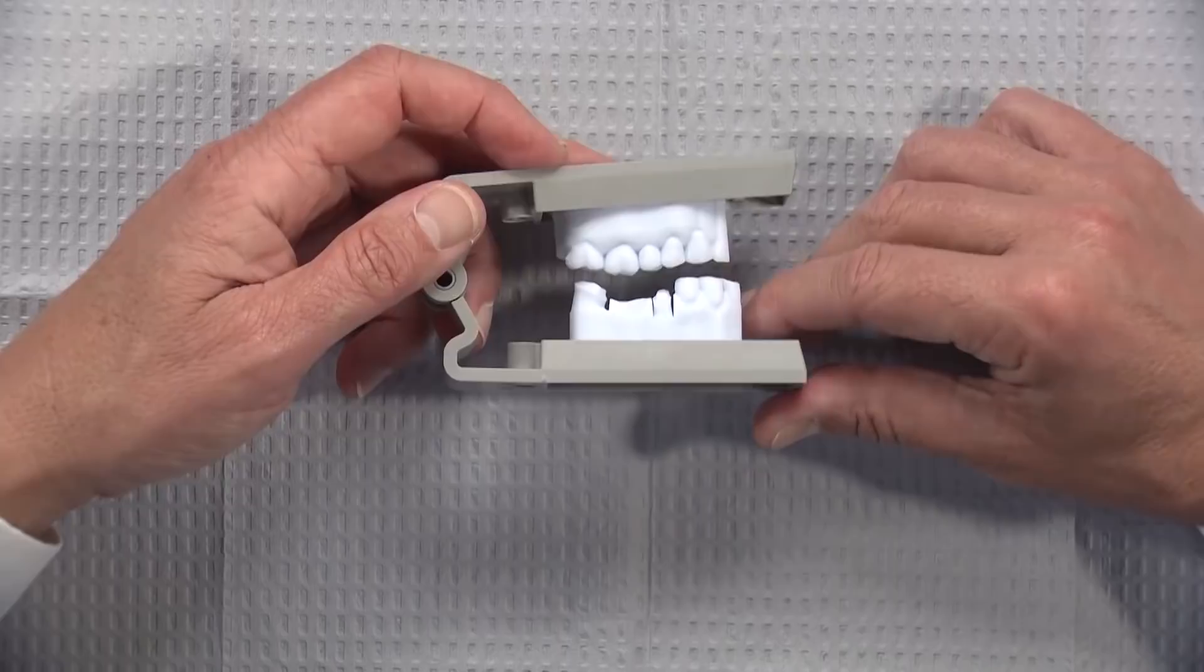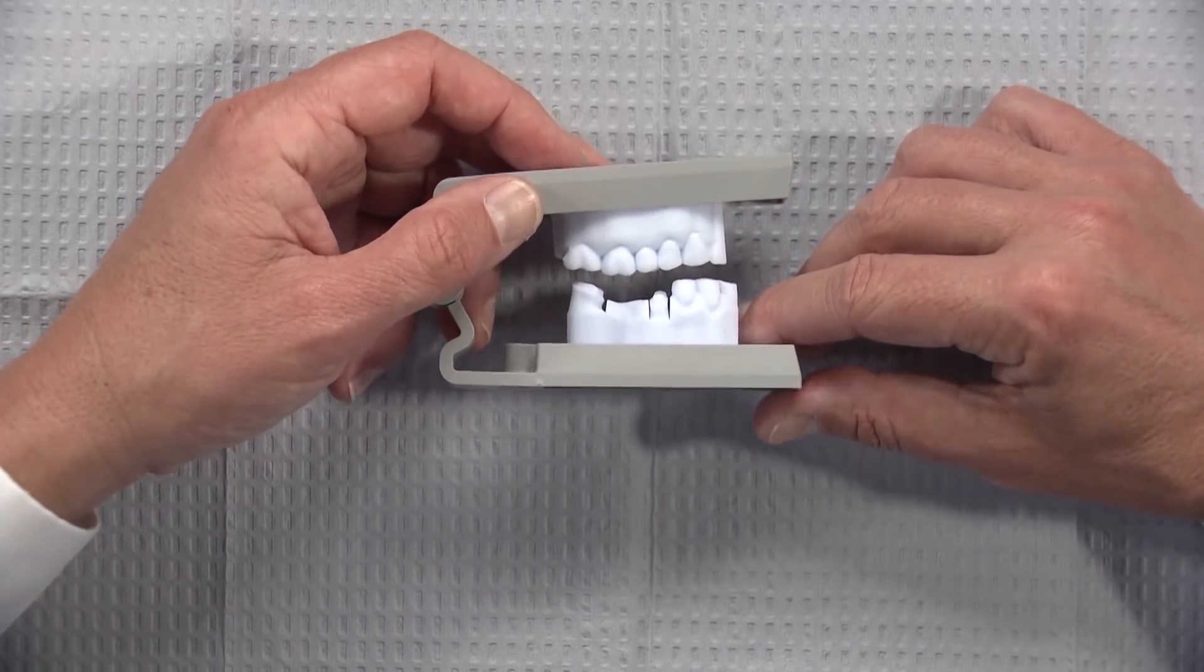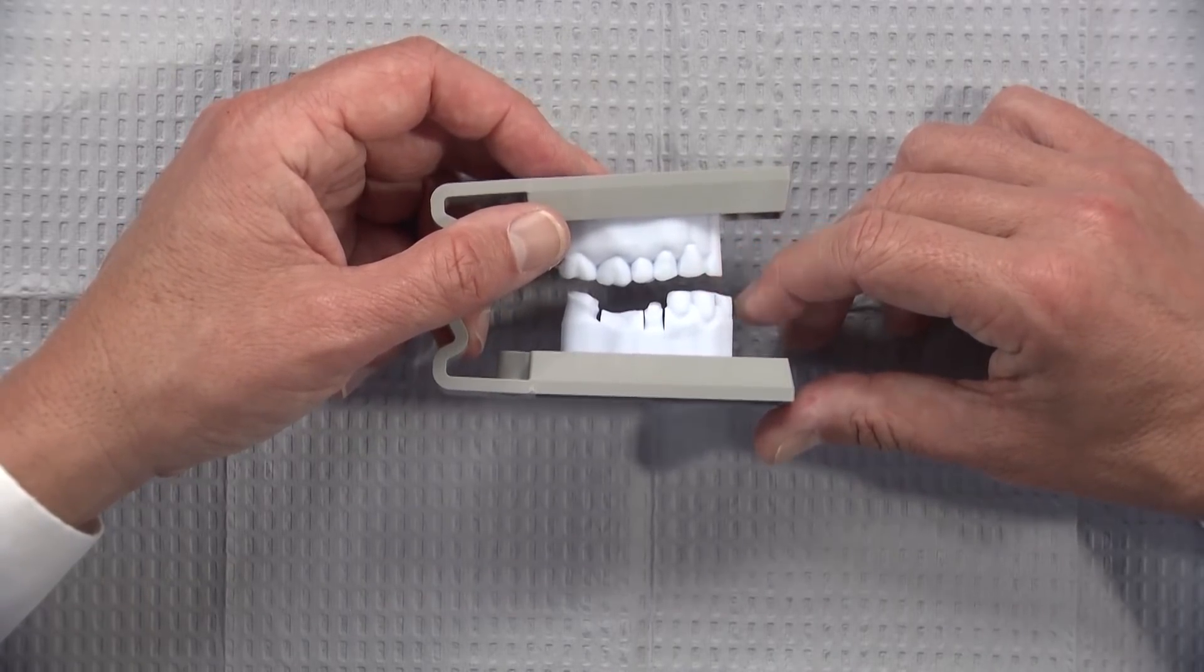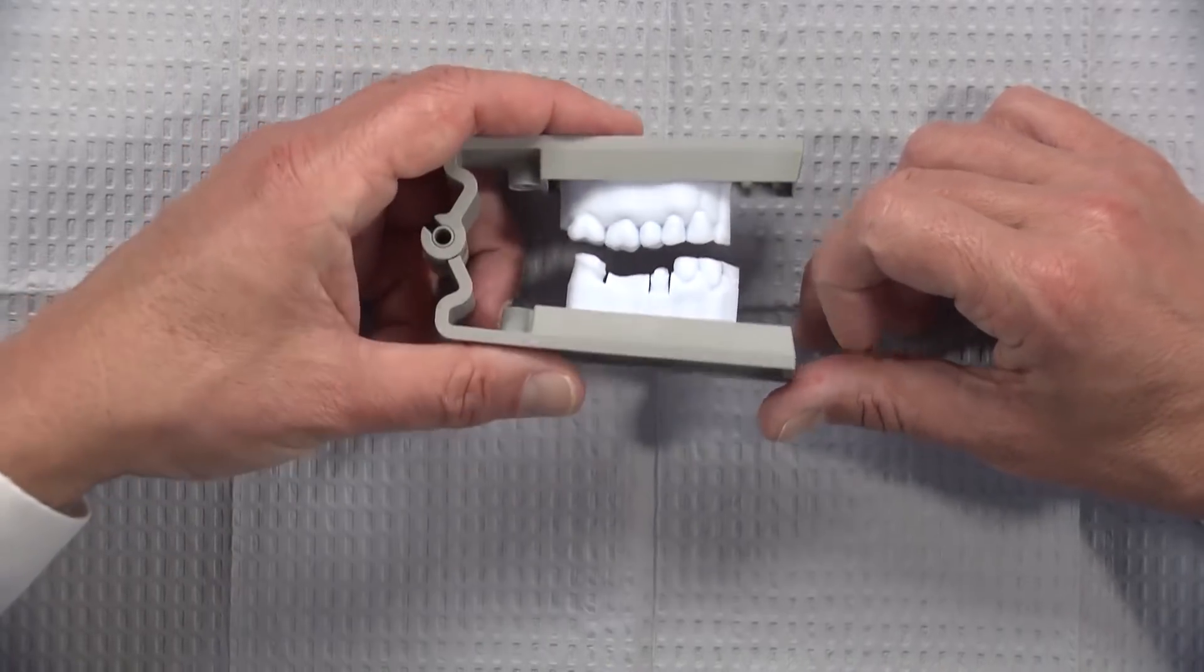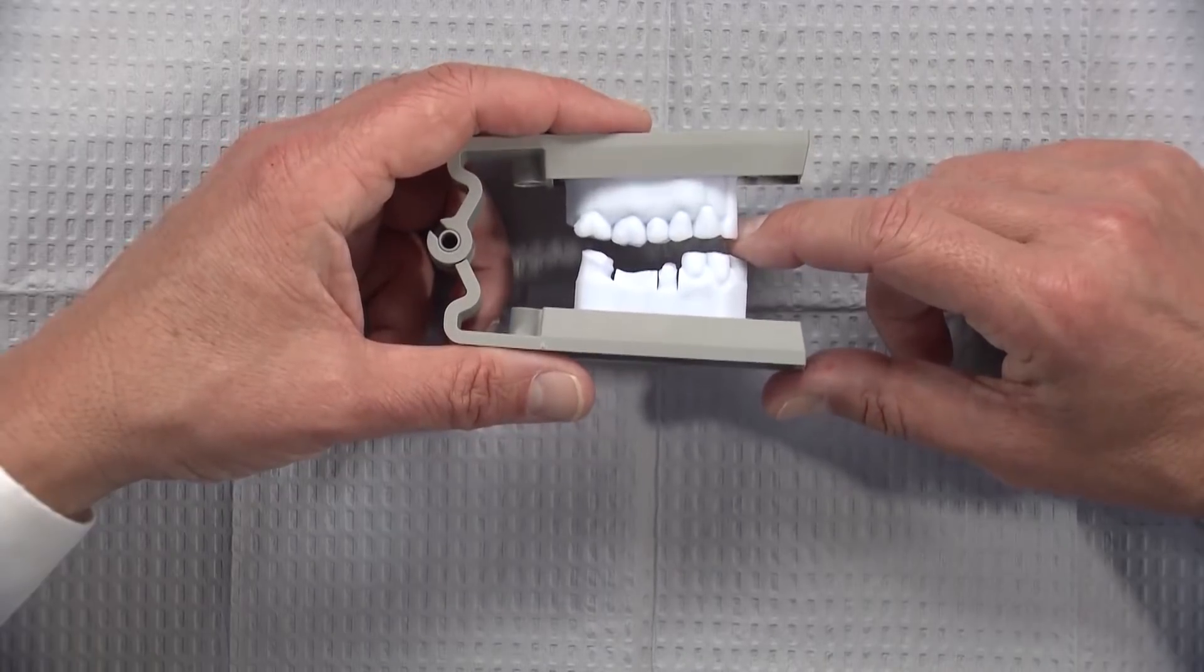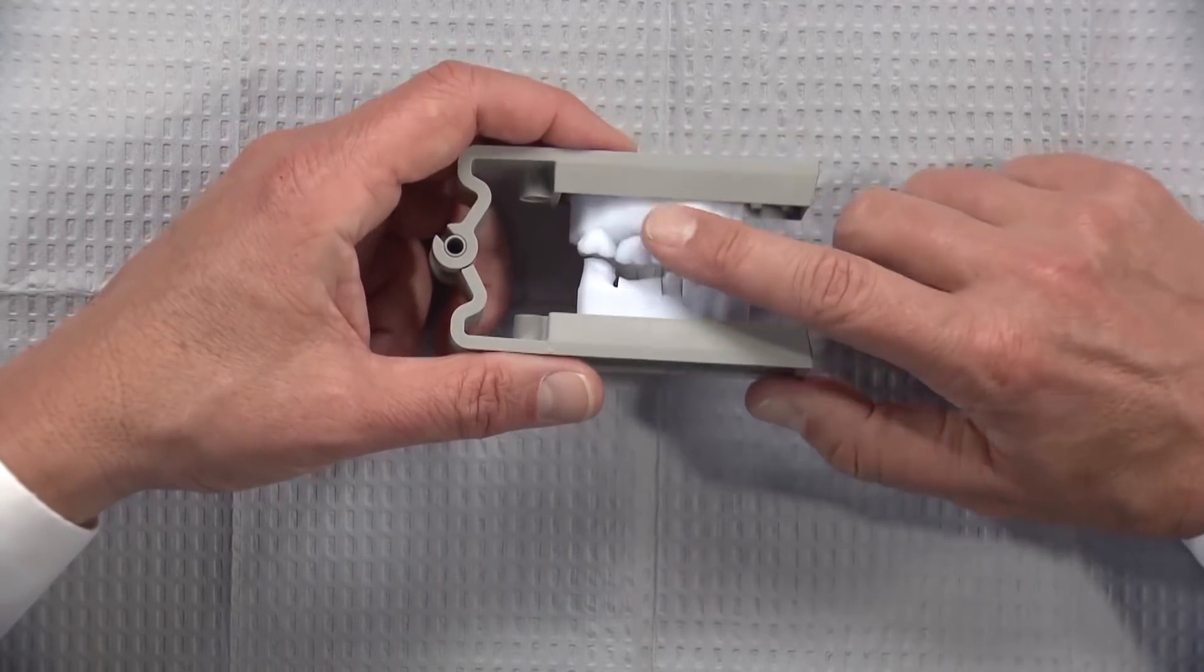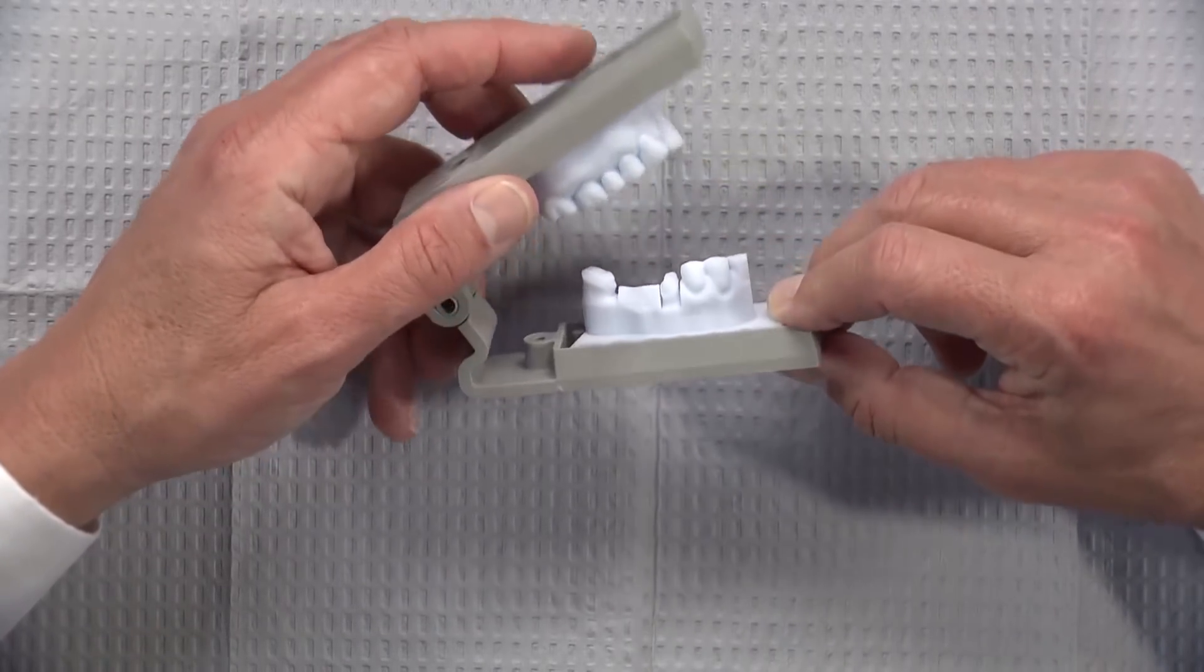If you use our Clear Lock product where we will send you essentially orthodontic retainers or Essix retainers, we'll send you three upper and three lower. If the patient loses them or the dog eats them and you need three more, this is what we do. We take that stored digital impression that you made or that we made from a stone model and then we'll print models like this.